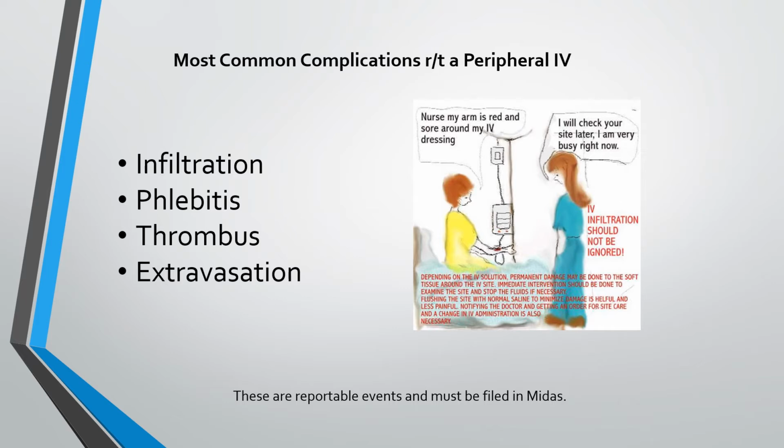The most common complications related to a peripheral IV are infiltration, phlebitis, thrombus, and extravasation. All of these are reportable events and should be filed in MIDAS.